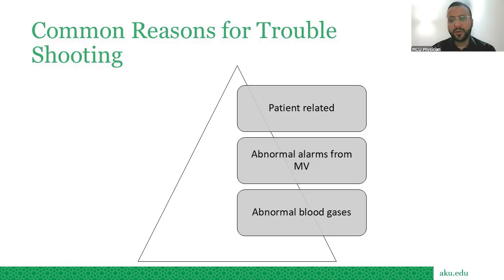Coming to the troubleshooting. Troubleshooting can be patient related, can be from abnormal alarms, and can be from an abnormal blood gas.